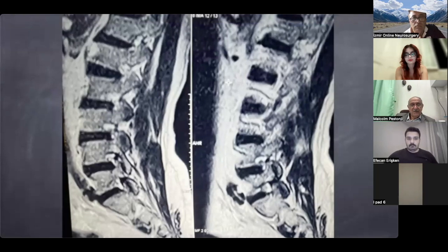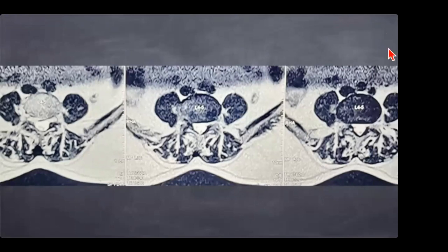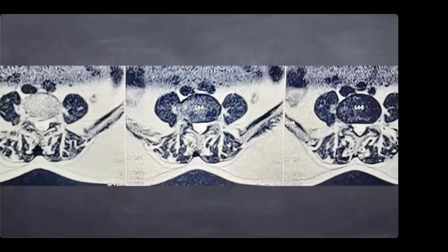There is a marginal foraminal stenosis at 4-5, slight anterolisthesis. If you were to see the axials, I don't know whether you would decide on surgery itself. You would most probably give this patient some gabapentin, some analgesics, but this patient has been having this problem for the past 3 years. He has taken multiple root blocks. He has taken multiple epidural steroids. No relief in his symptoms.